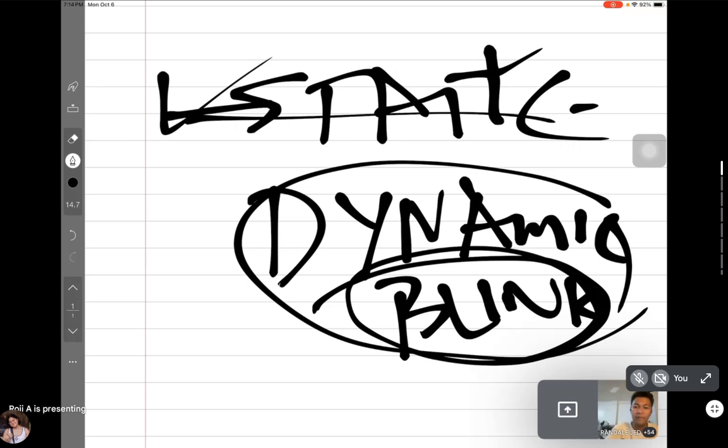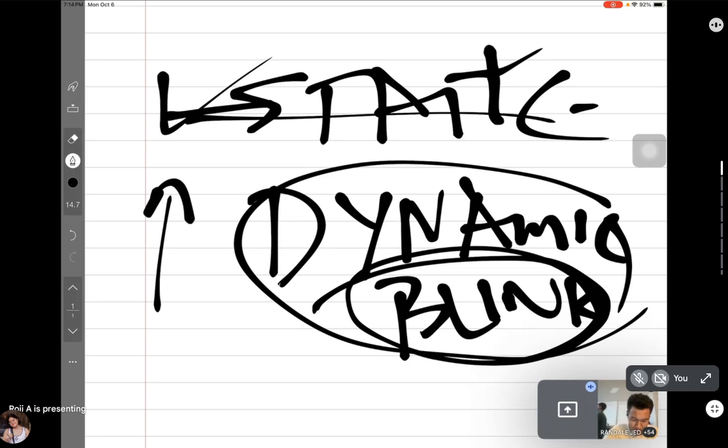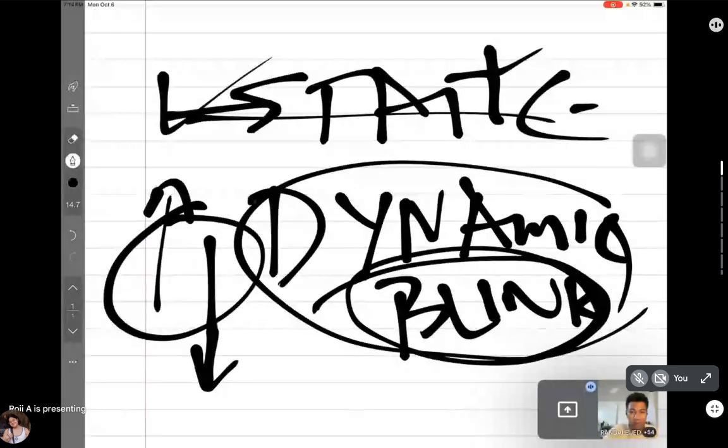Okay. So remember, when doing two things that's happening right away by looking up. Look up, blink. I would look at the going up of the contact lens and the going down. I am doing static and dynamic at the same time. So when I ask the patient, look to the right, did you say blink?